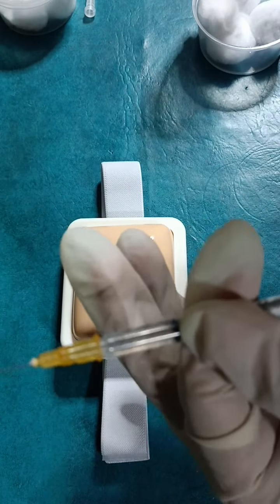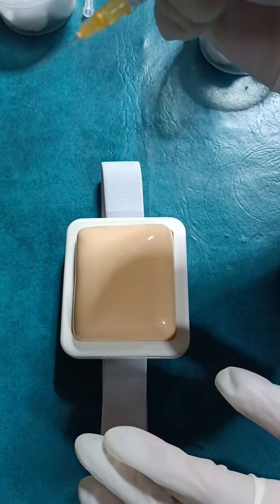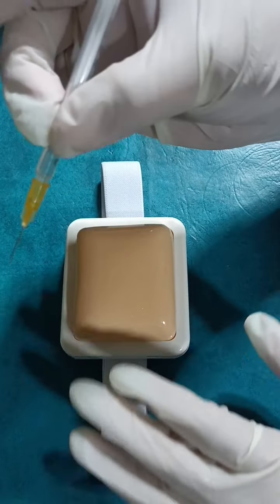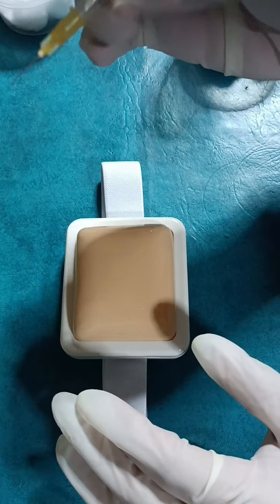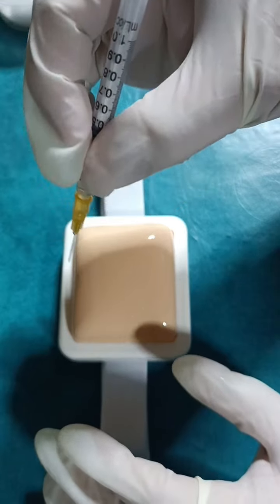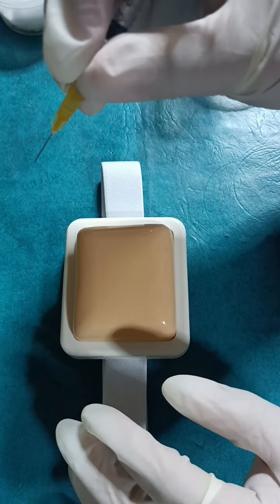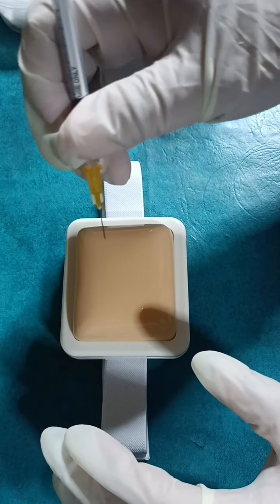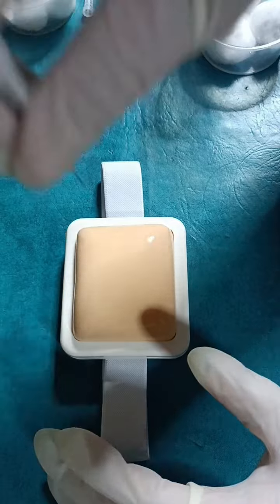In injecting the medication, grasp the syringe in your dominant hand, holding it between your thumb and fingers like this, with the palm facing upward for a 45-degree angle insertion, or with the palm downward for a 90-degree angle.